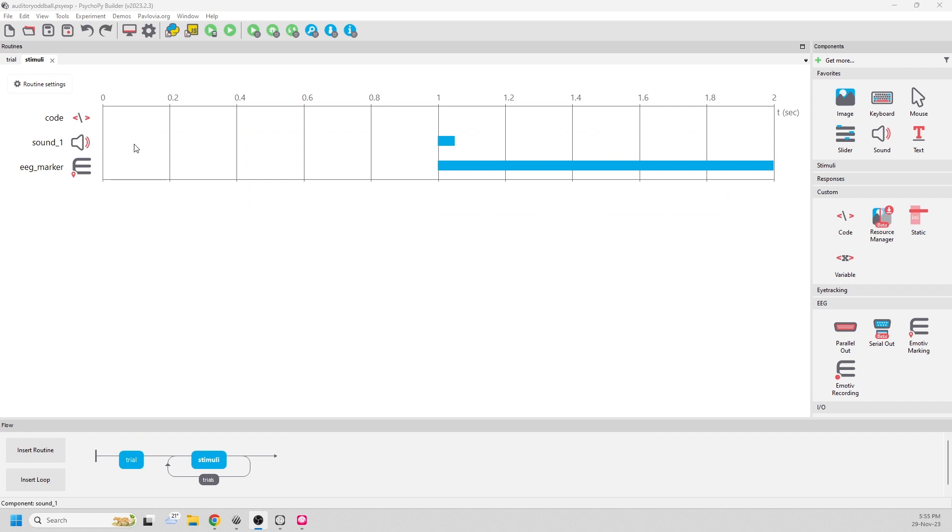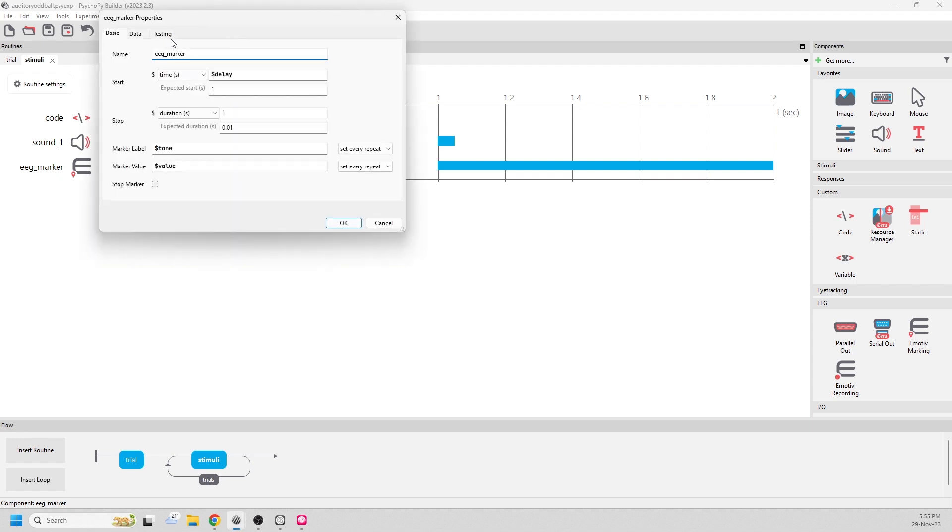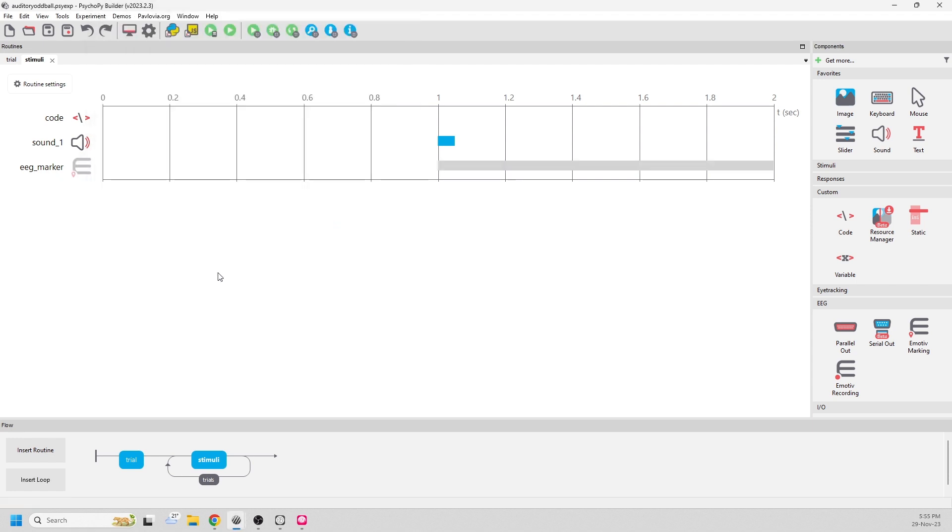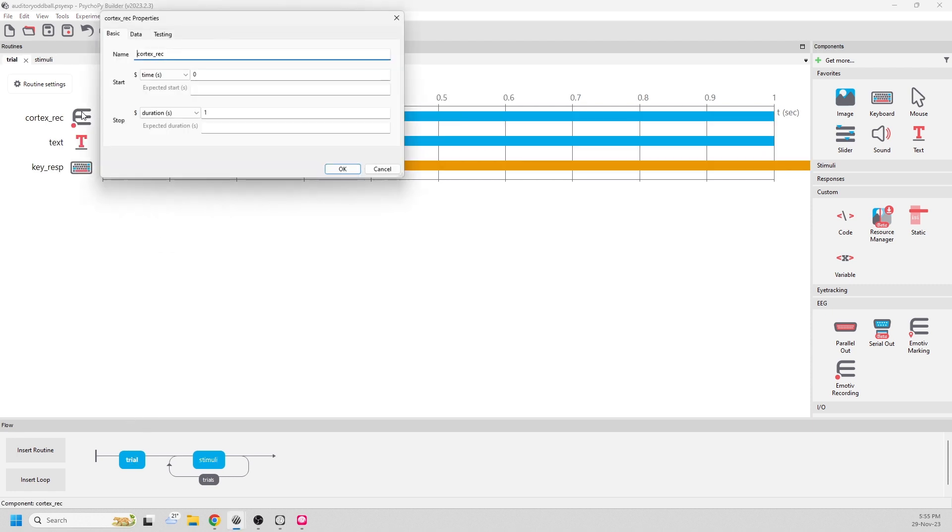Now we're ready to test our experiment. It's a good idea to first test your experiment by disabling the Emotive components because it won't run unless you have an Emotive headset connected.